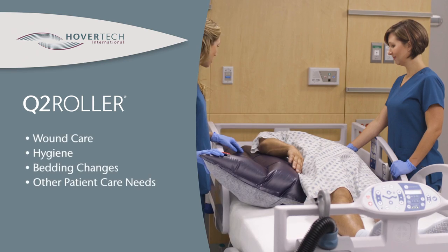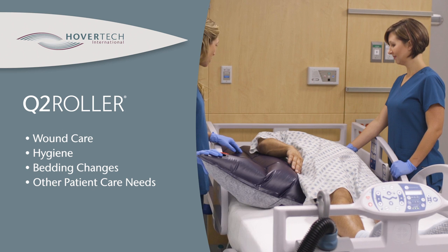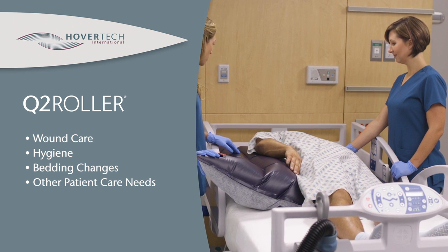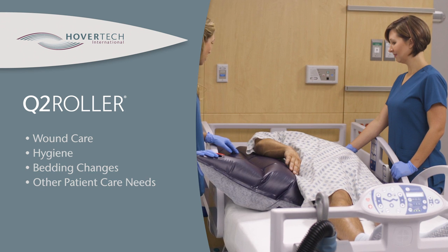The Q2 Roller can help with patient positioning for wound care and hygiene, bedding changes, and any other patient care needs that require the patient to be in a side-lying position.